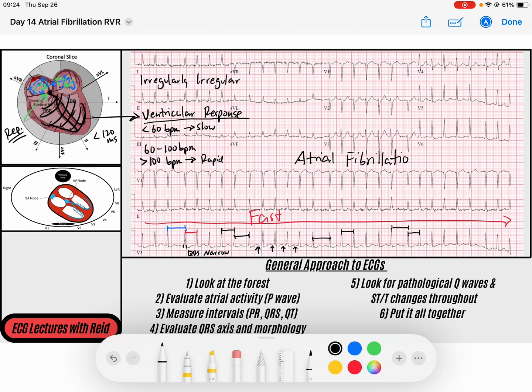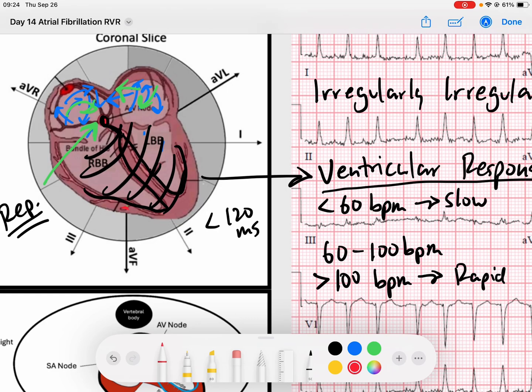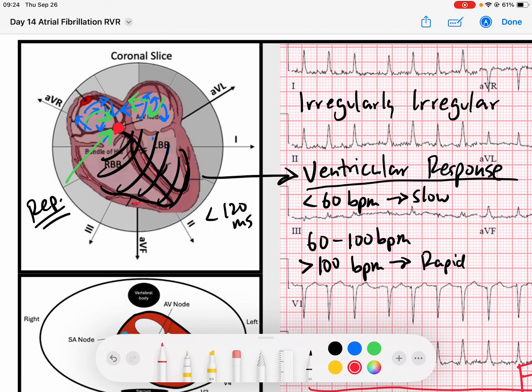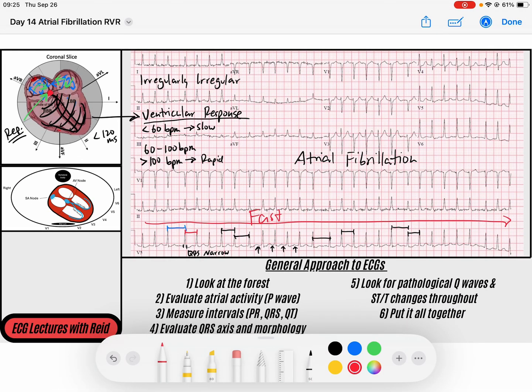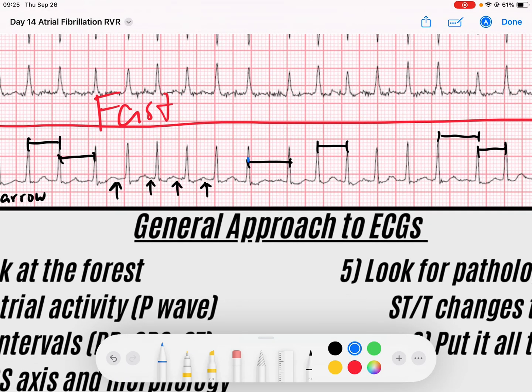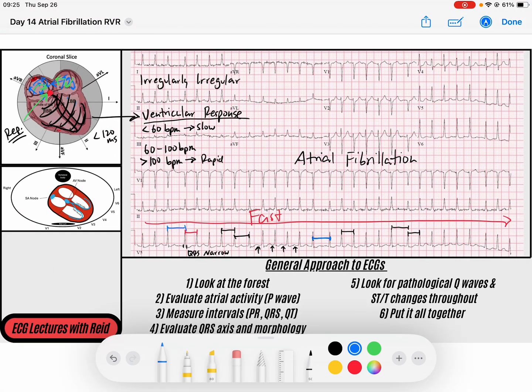Now that we have atrial fibrillation, we need to determine the ventricular response: slow, normal, or rapid. Remember, that's a function of how the AV node conducts the signal. You can't really look at one R-to-R interval and calculate the rate in AFib — sometimes you have to calculate the rate over a period of time. I know that this EKG strip is 10 seconds long, so the number of beats times six would give me 60 seconds — essentially how many beats would happen in a minute.